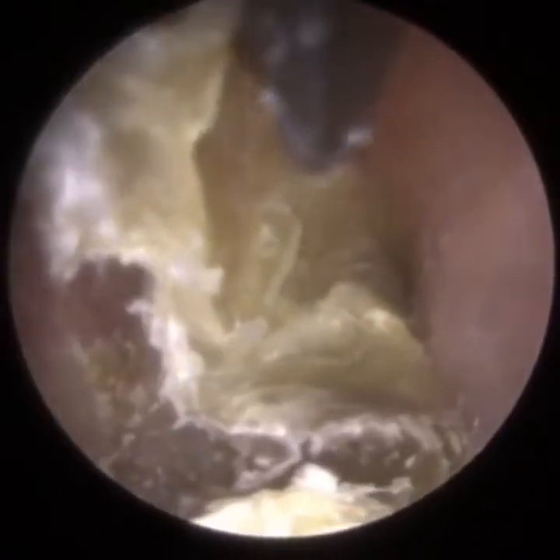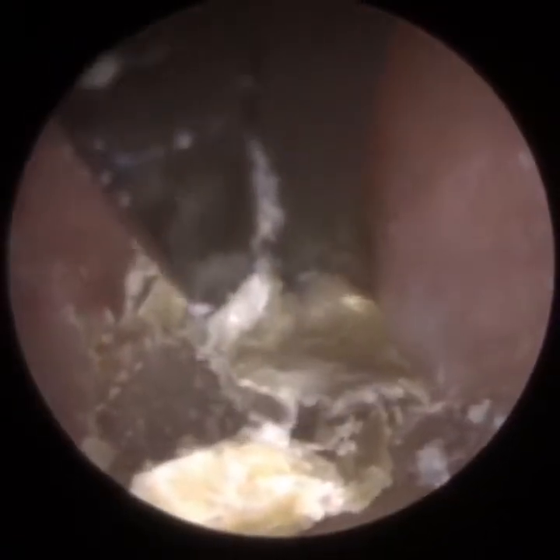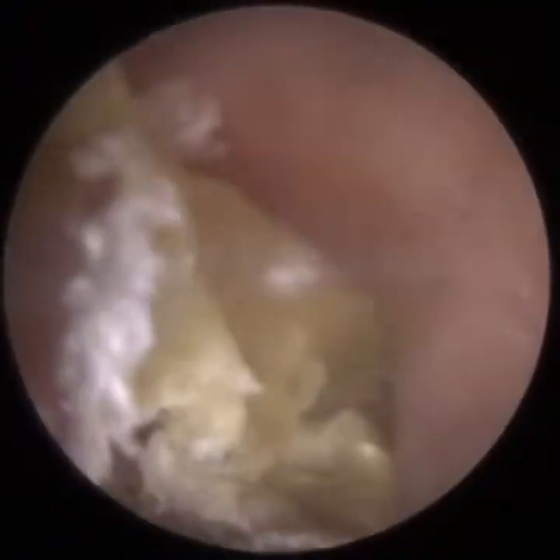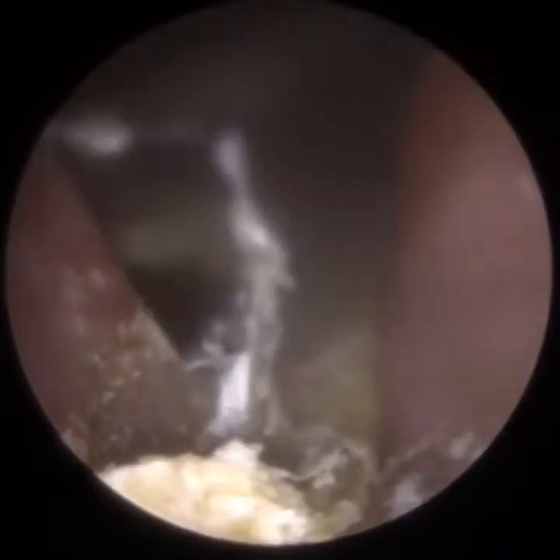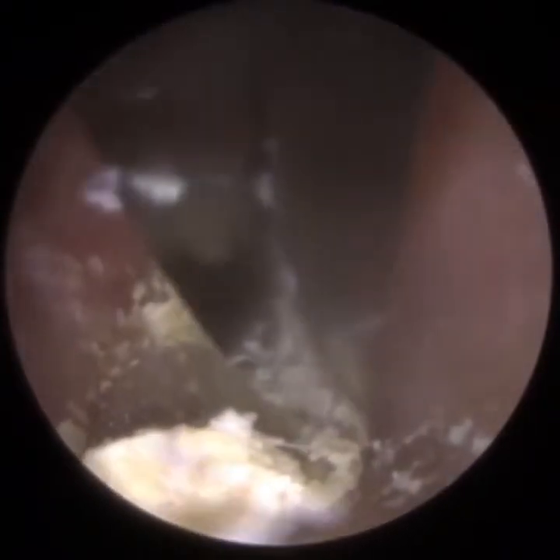I'm just pulling the skin downwards now, from top to bottom, just to, again, loosen it off the ear canal. I believe this time I'm going to get a good grip, and I'm going to gently wiggle this skin forwards, left and right and forwards, so it comes off the eardrum and out of the ear. The patient has got quite a narrow ear canal. You can tell that by how much the forceps is taking up the internal space of the ear canal. The patient is unfortunately very still for me to do this.